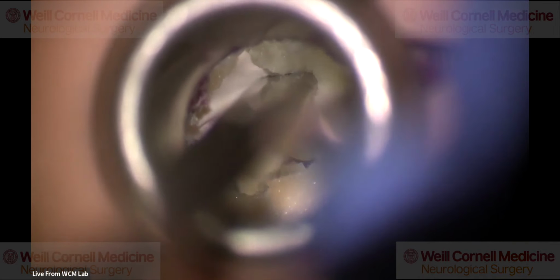So here, I bite the ligament. See how I bite a little bit, and then before I commit to the bite, I move the curette and look at the dura, because I don't want to accidentally grab the dura. And since I'm not in focus as much as you guys are, now I want to be extra careful here. Like this. So now I'm going caudally. I'm taking the ligament.